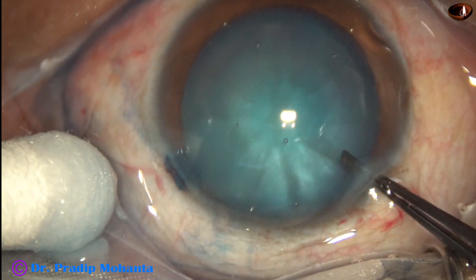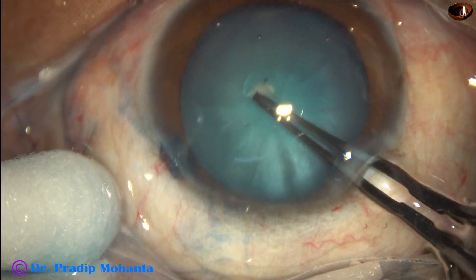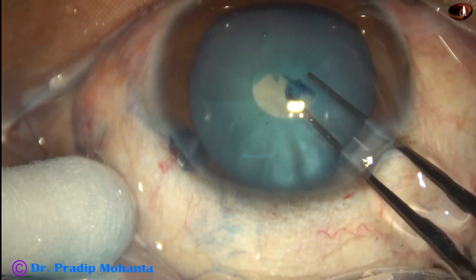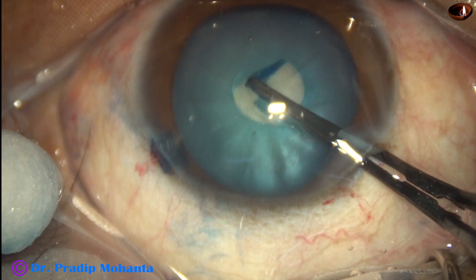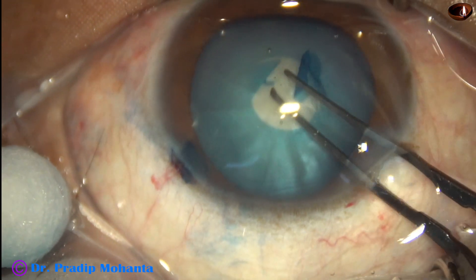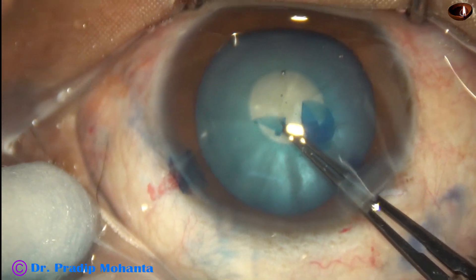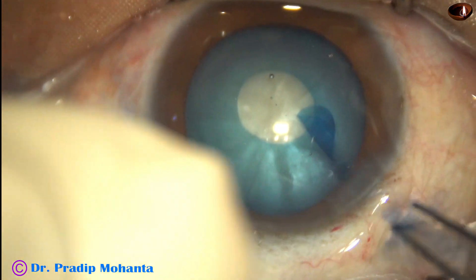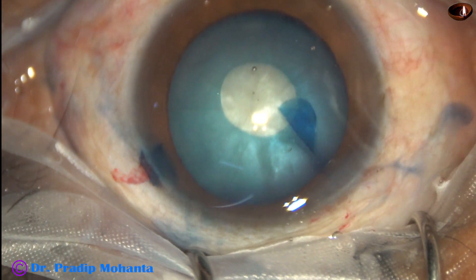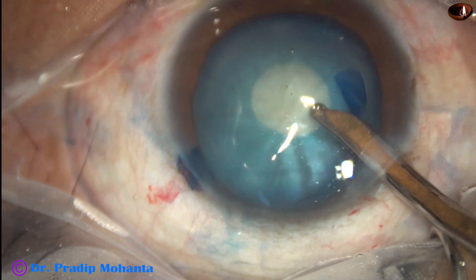Why utrata forceps? Because as soon as we puncture, the flap may tend to go to the periphery. So we can easily catch swiftly the tag and we may be able to retrieve the rhexis — retrieve the runaway.